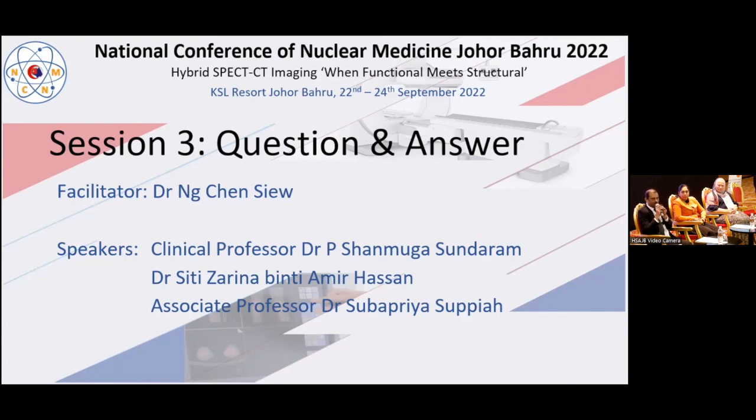That is number one. Number two is, of course, follow up, as Dr. Chen highlighted, to be done with all patients, and I use contrast CT very limited in children and adolescent patients, obviously, and I don't overdo special procedures like three-phase. Three-phase CT, many centers do it as a routine if there is a liver pathology that is suspected. So I do that mainly for hepatocellular carcinomas, HCCs, or neuroendocrine tumors. Otherwise, I don't do that. So we are selective in that approach.